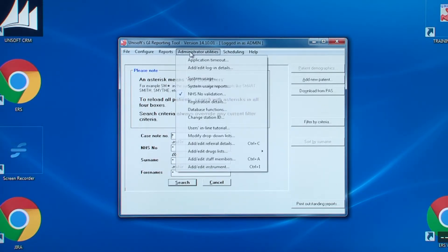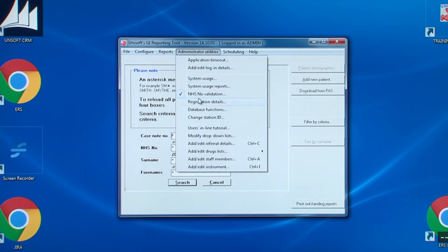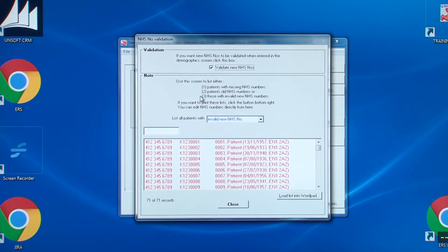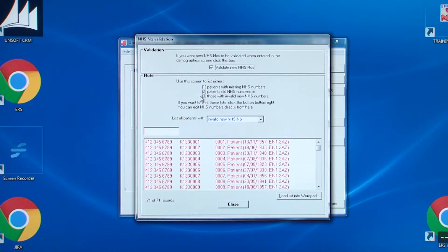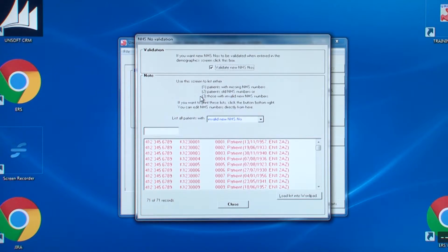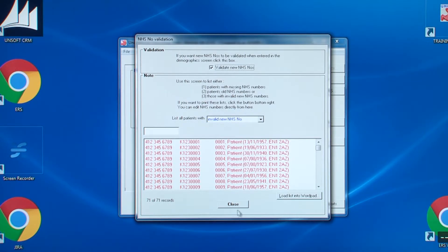Then, the next entry is NHS number validation. This is for those very few hospitals without a PAS interface. It allows you to view and change the details for patients, either with invalid, old or missing NHS numbers.